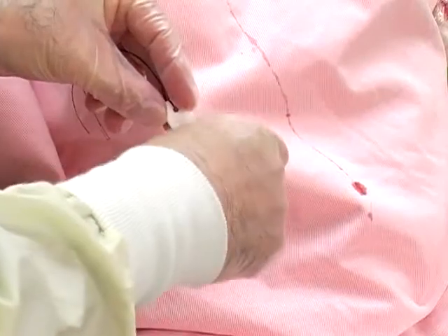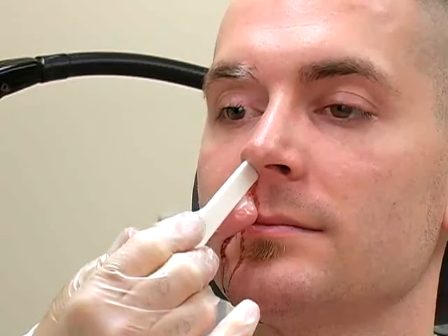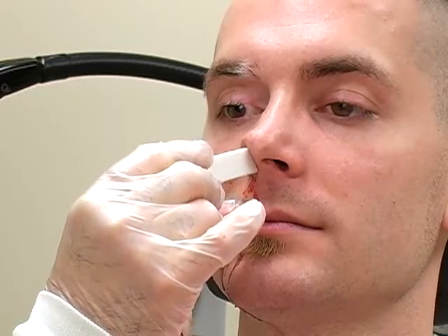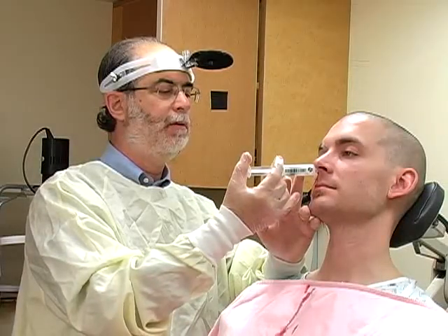The insertion of the larger Merocel sponge, which is indicated for more substantial hemorrhages, is performed in a similar fashion. First, lubricate the device with a topical antibiotic ointment. Insert it into the nares at a 45-degree angle and advance it 1 or 2 centimeters before bringing it perpendicular to the face and advancing it posteriorly into the nasal cavity. Once inserted, rehydrate the sponge with 3 to 5 milliliters of saline solution.